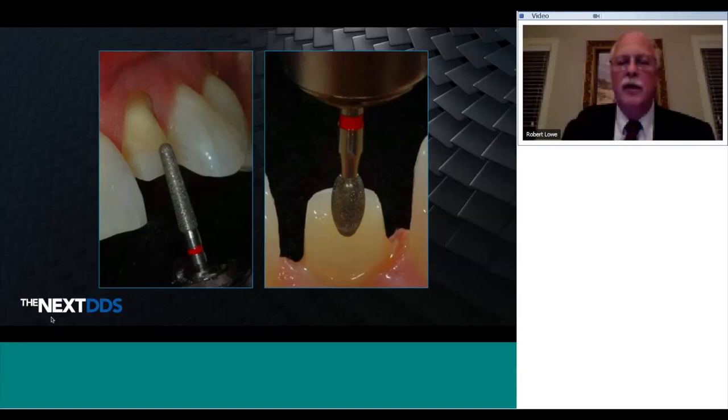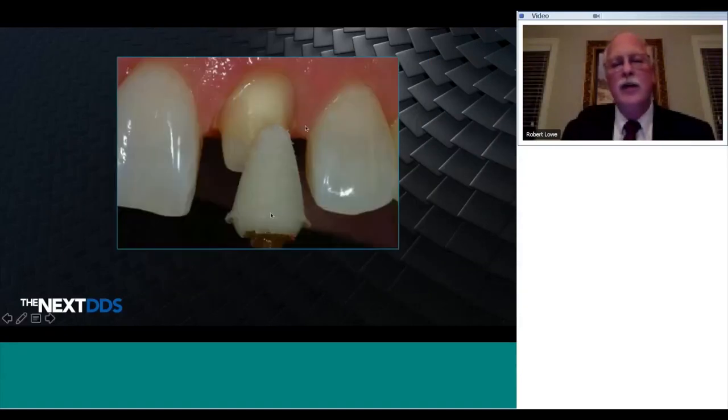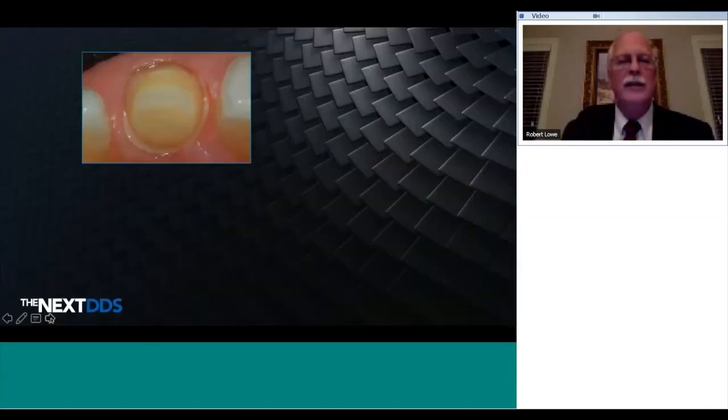I'm using the elliptical burr to smooth the palatal surface. And then my last step is to use an enhance point. This is a composite polishing point, but it's going to smooth the prep and round the edges to make sure that I have a nice, smooth die as my final preparation.